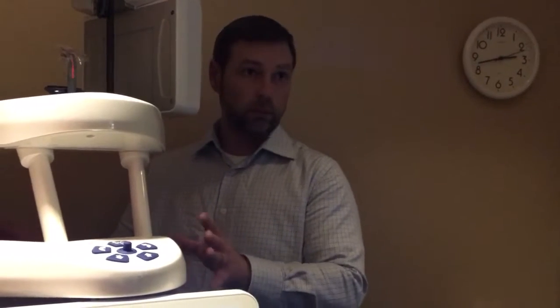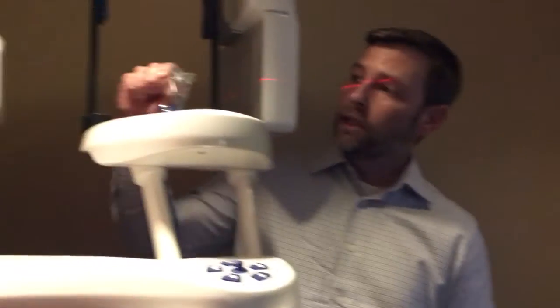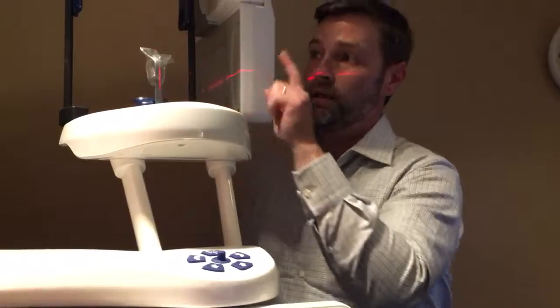Patients are always going to do the wrong thing if you let them, so take control. Be careful when having them bite on the stick — make sure it's edge-to-edge. That's the part they'll always cheat on, because edge-to-edge is not their natural bite and it's uncomfortable. The goal is to make sure the front two teeth don't contact. When you stick them in, have them bite down, then say 'smile' — verify you've got both sets of teeth edge-to-edge. That's a big common error.